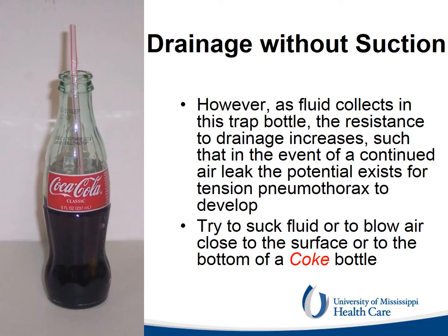To better understand this concept, try to suck fluid or to blow air in a bottle first at the surface, then close to the bottom. The latter requires more effort.